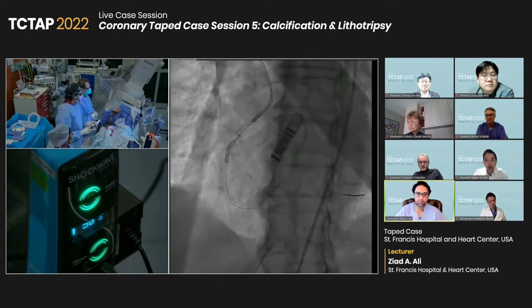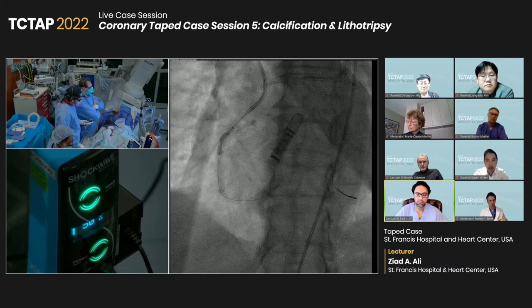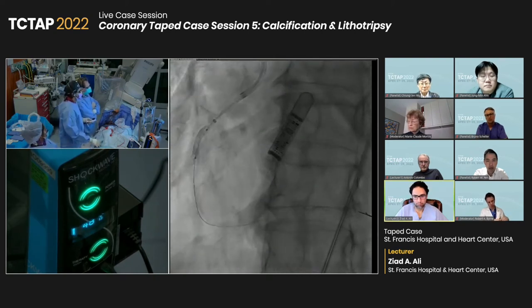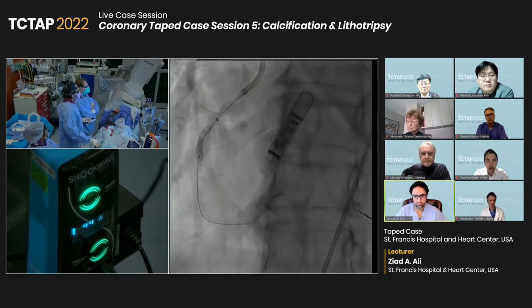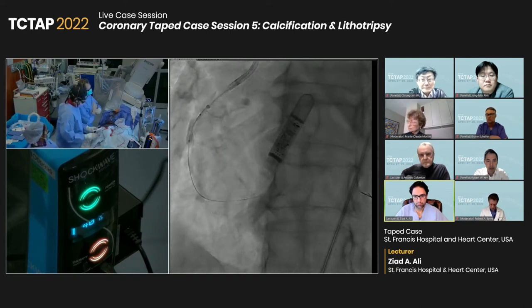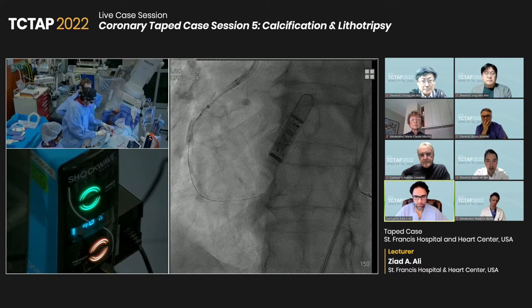It looks like there's only one bubble here. You'll see what's going to happen with this bubble. Let me fluoro up the mag. As we deliver this fluoro, you're going to see the bubble starts moving around. Now there's two. So let's deliver a few pulses, a little bit more proximal around that bend as well.